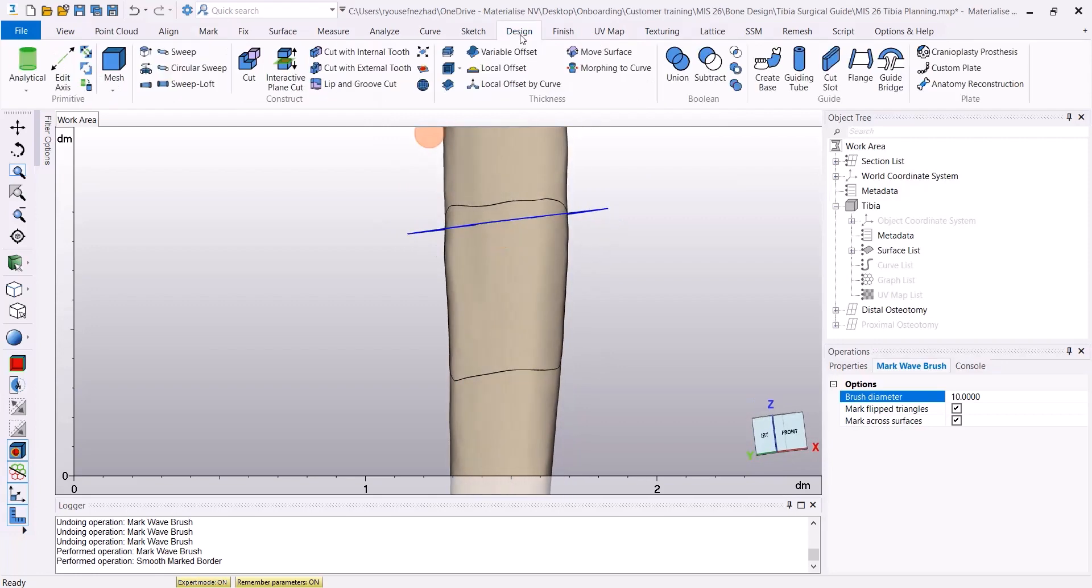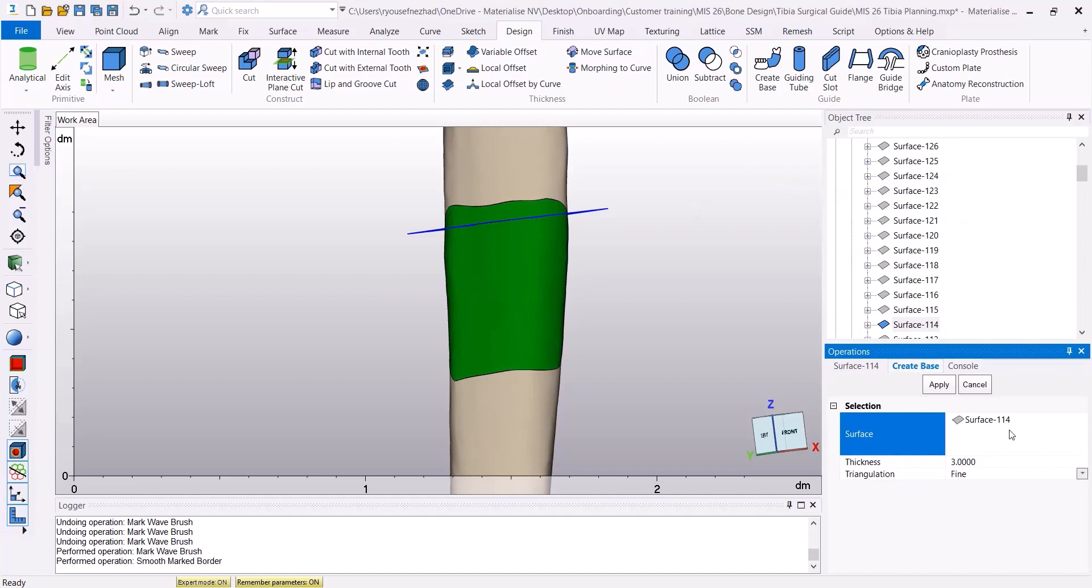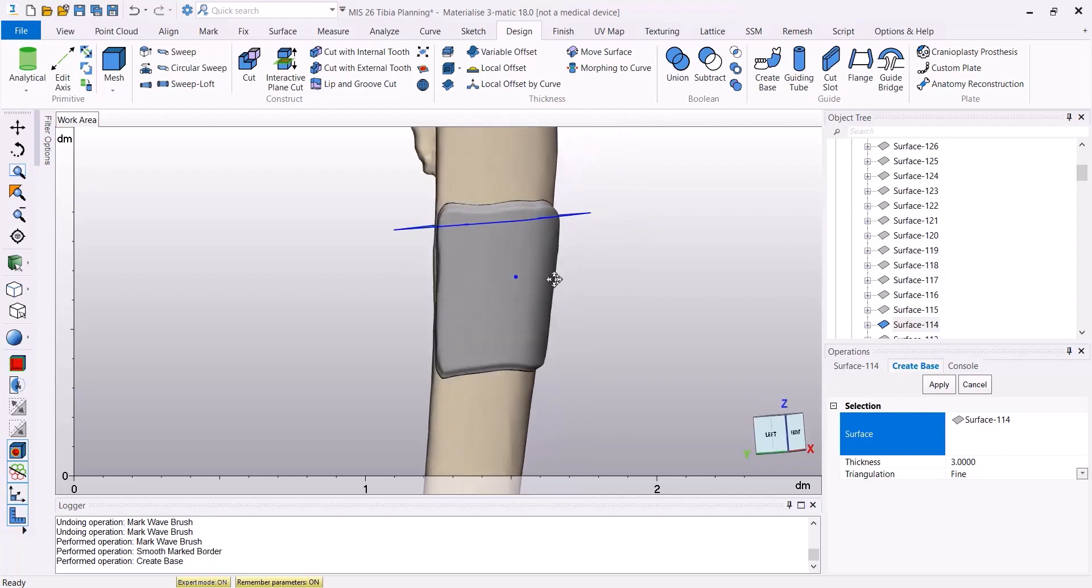Then under the design menu, I'm going to select create base tool, select the surface that I have marked, and click Apply to create the base.